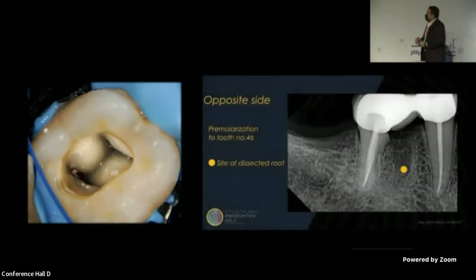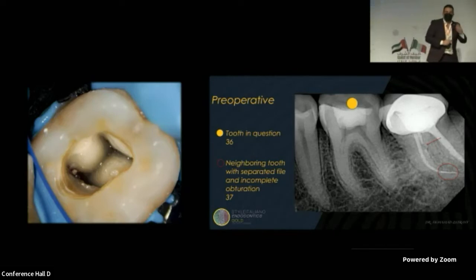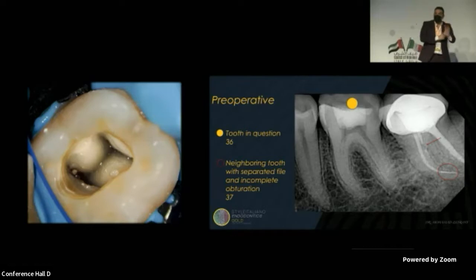In a case like this, this patient came to me and she has a strange request. She's telling me, doctor, please, I don't want a file to be separated in my tooth. She didn't tell me, doctor, please finish me quickly, I want to finish in a single visit. No, please, doctor, don't separate a file in my tooth. I lifted my instrument and said, please speak, what's your problem? She's telling me, every time I'm doing endodontic treatment, I have file separation, file breakage in my tooth.